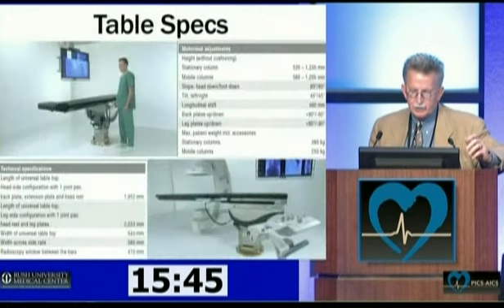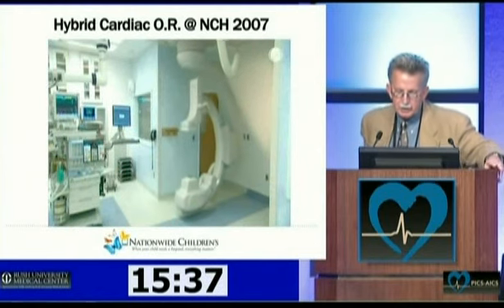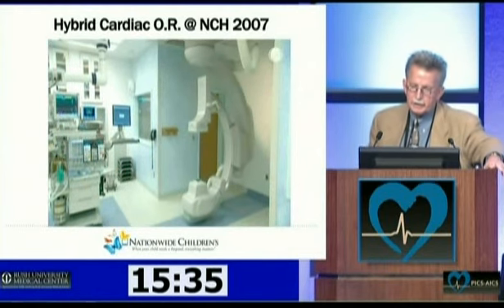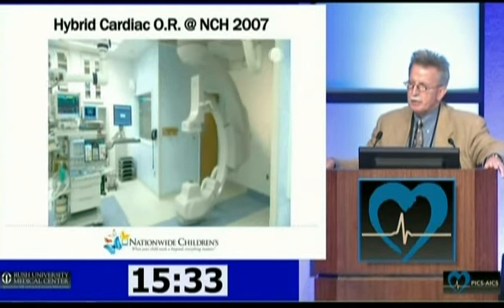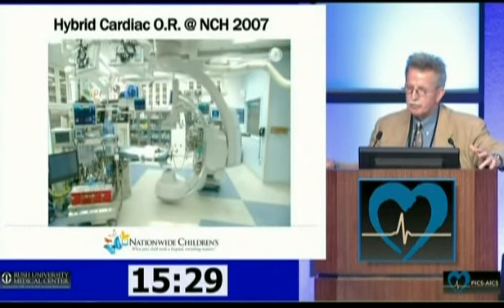And so you can see this is the Magnus table that we have currently in our hybrid OR. It has lots of great different kinds of movements. And this is currently the hybrid OR suite. The imaging equipment is ceiling mounted. It parks completely out of the way, so it looks like a standard OR when you first come in.